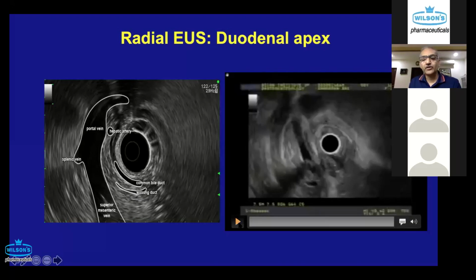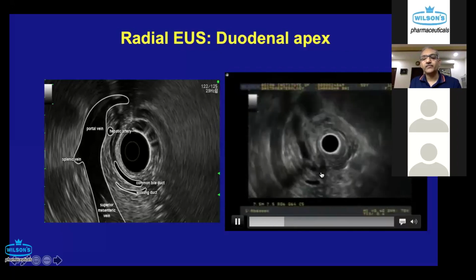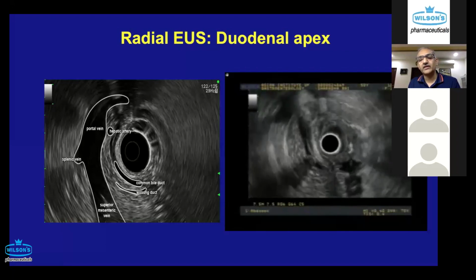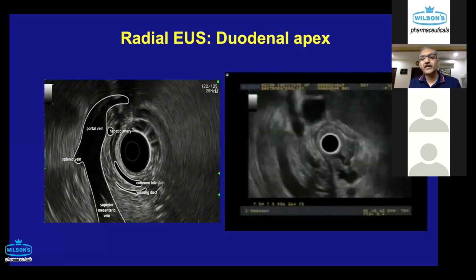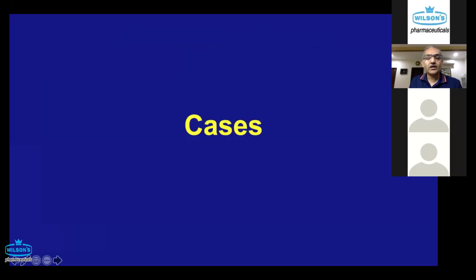Let me show you a video. On the right side, almost similar to what you see on the left, is a bile duct stone. I'm sure anybody who is doing a little bit of ultrasound would know that this is a bile duct stone. This is one of my favorite images from quite some time back, more than 15 years ago, which I had grabbed. So let me show you some interesting cases that will probably interest the audience.